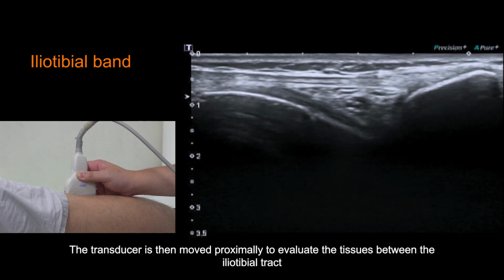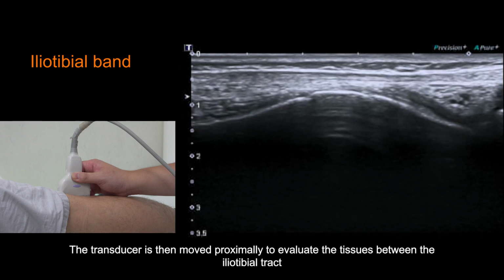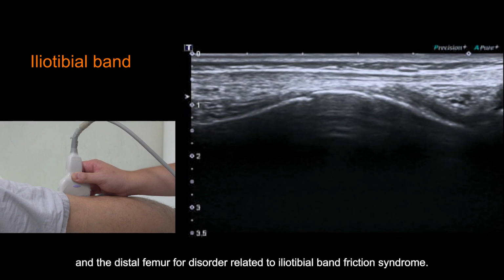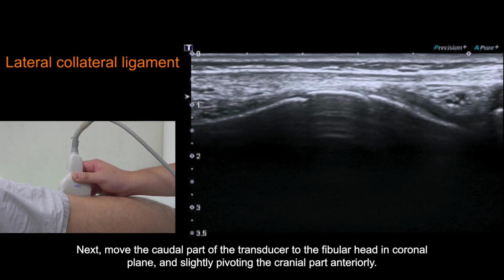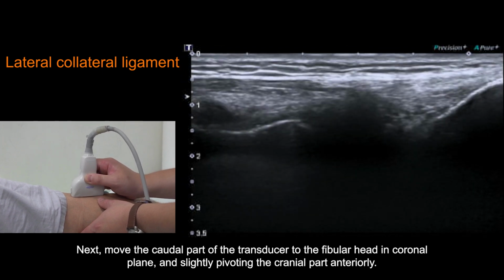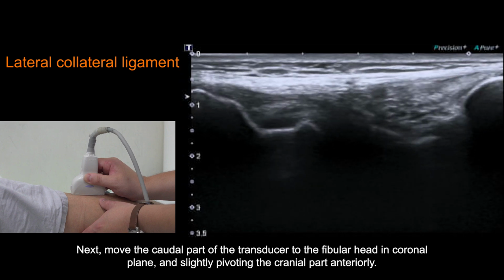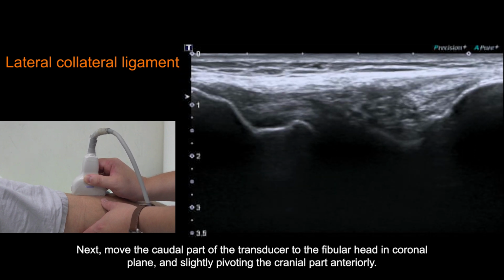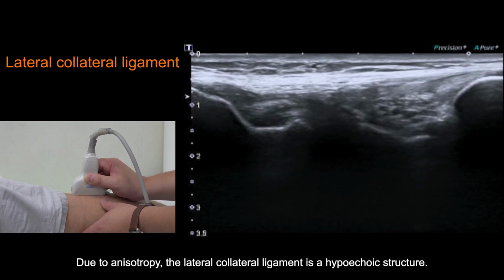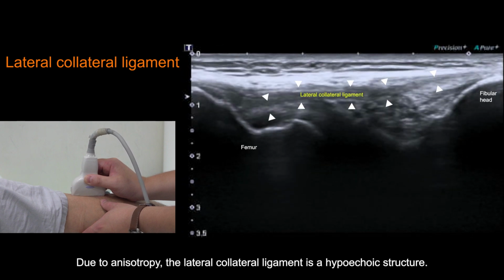The transducer is then moved proximally to evaluate the tissue between the iliotibial tract and the distal femur for disorders related to iliotibial band friction syndrome. Next, move the caudal part of the transducer to the fibular head in the coronal plane, slightly pivoting the cranial part anteriorly. Due to anisotropy, the lateral collateral ligament is a hypoechoic structure.